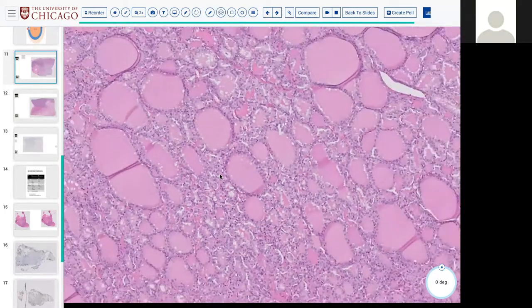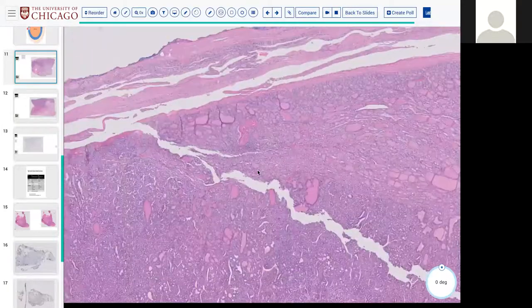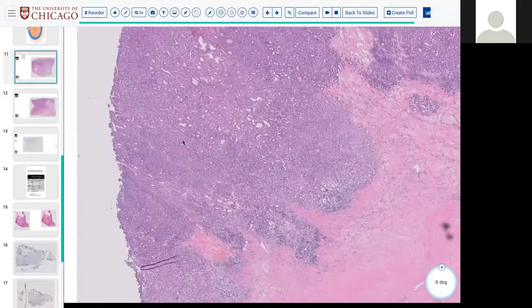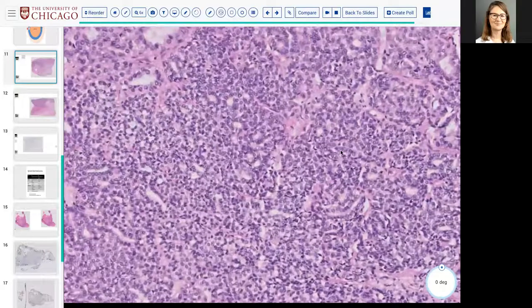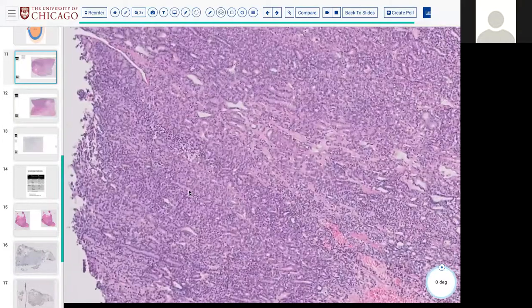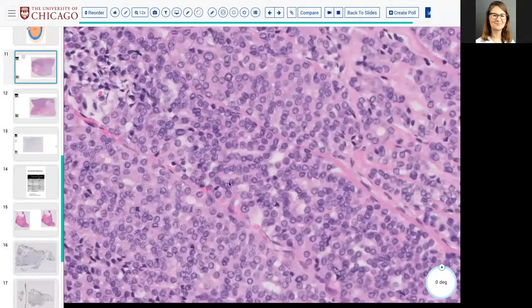Yes. And in comparison, we have at the left here, we have pathology here. Yeah. It's more solid. Like we are not able to recognize. No, we see microfollicles, but it tends to become more solid. Again, right. You sort of walk from side to side and you don't encounter a lumen. So good. There is at least focal solid.